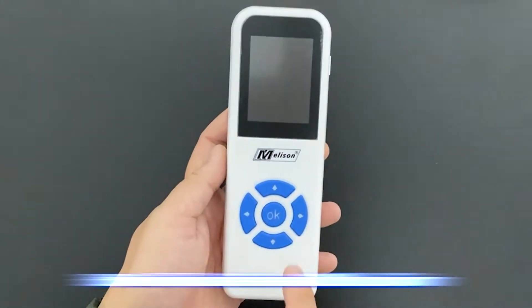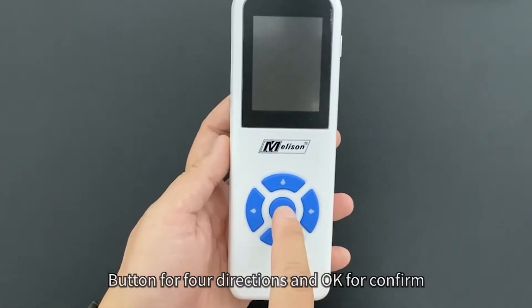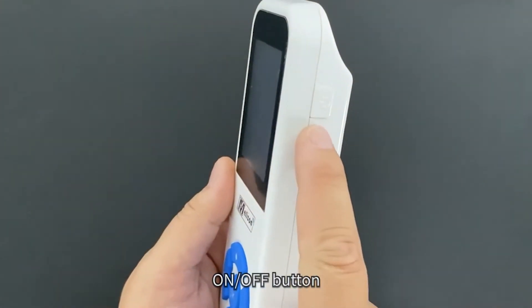OAE hearing screener operation introduction. The device has buttons for four directions and OK to confirm. There is also an on/off button.